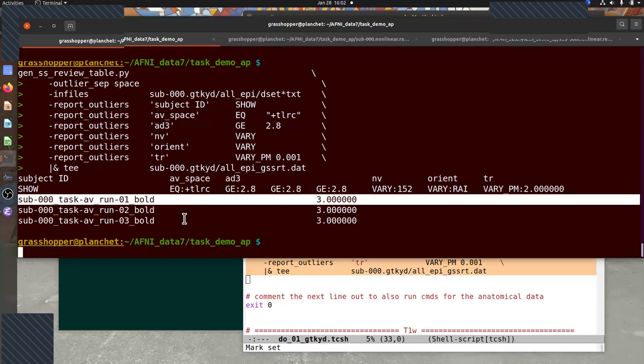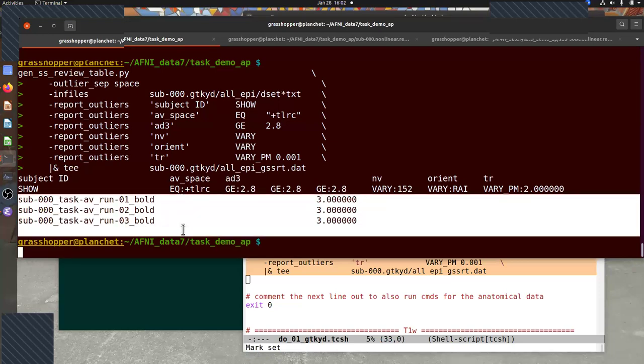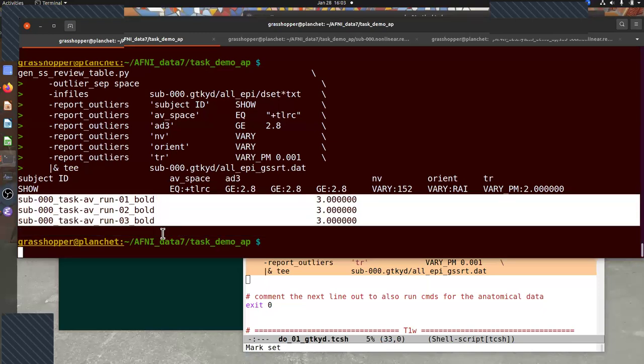This is so useful when you download a data set because, as I'll talk about briefly in this quality control project we did, the heterogeneity of properties was stunning. The voxel sizes were different. The number of TRs were different. The number of runs were different. It's as if people actually mush together different acquisition runs, different protocols, and that matters when you're processing your data. And it might even be an exclusion criterion, or a criterion for whether I should use this data set.